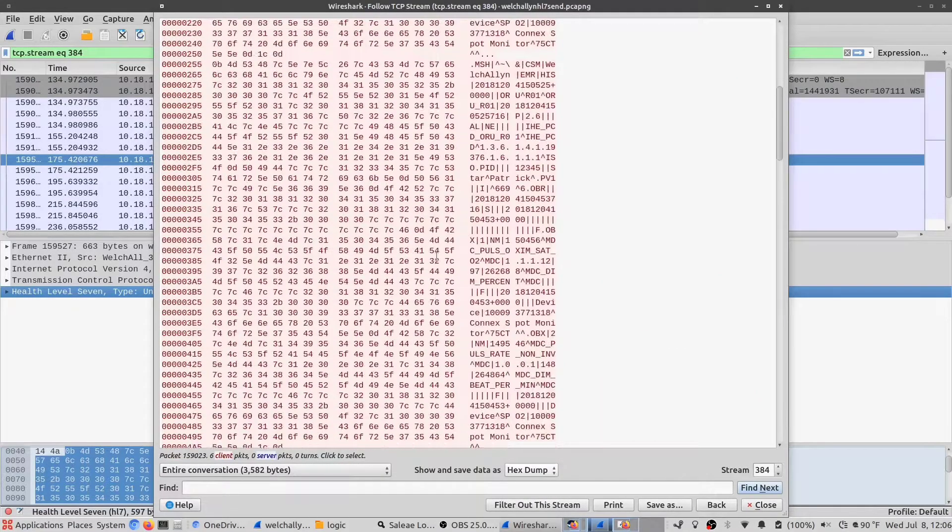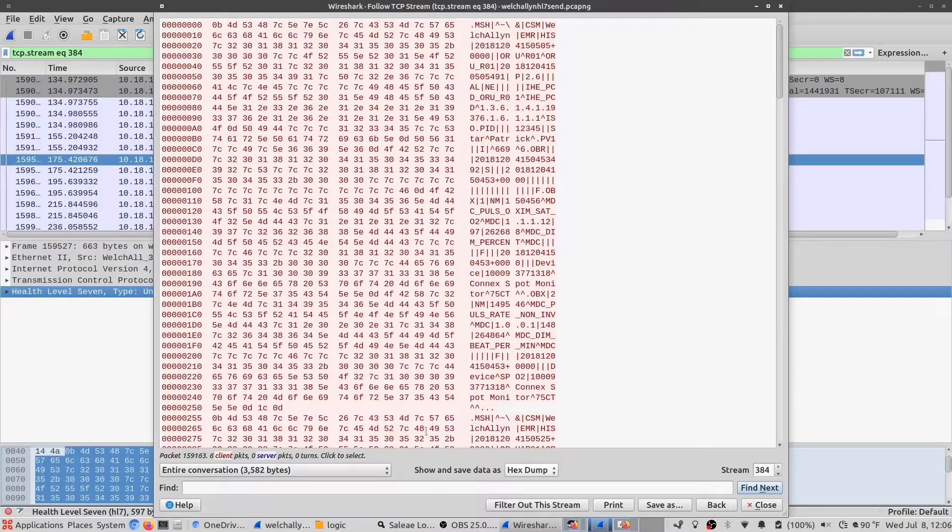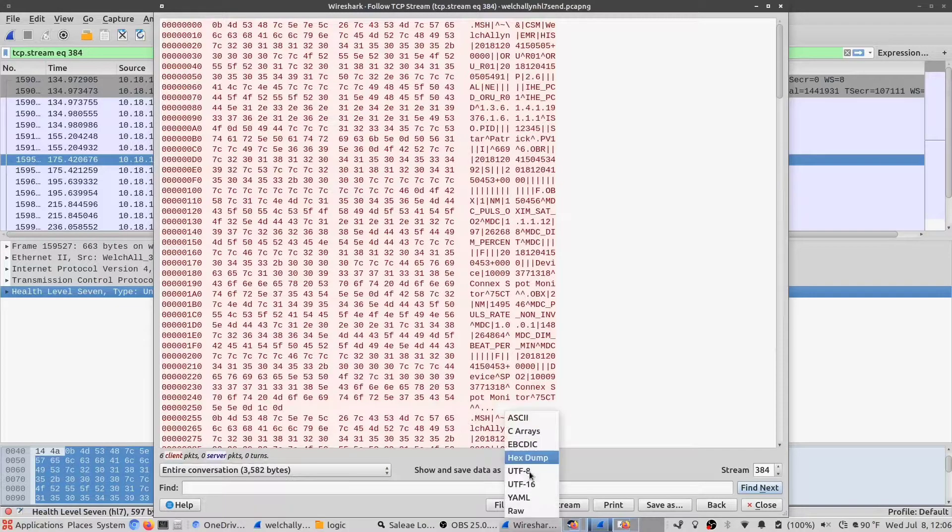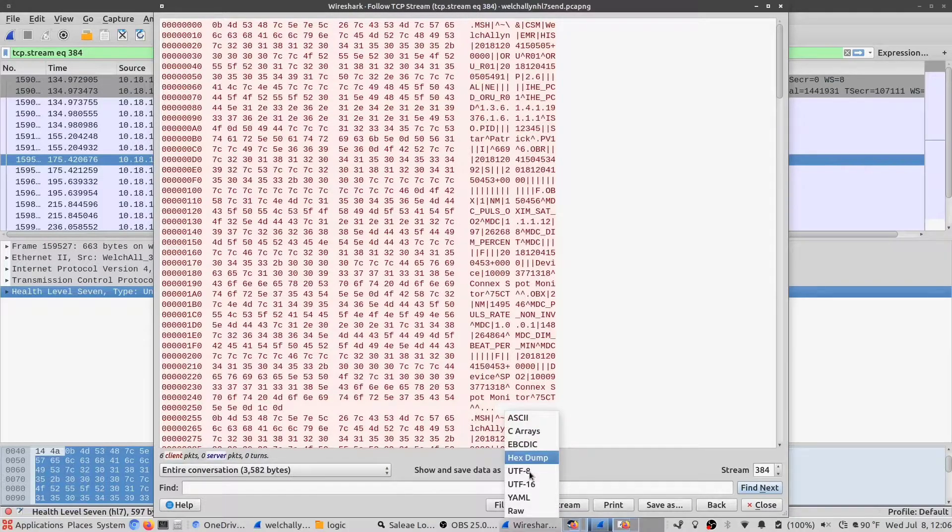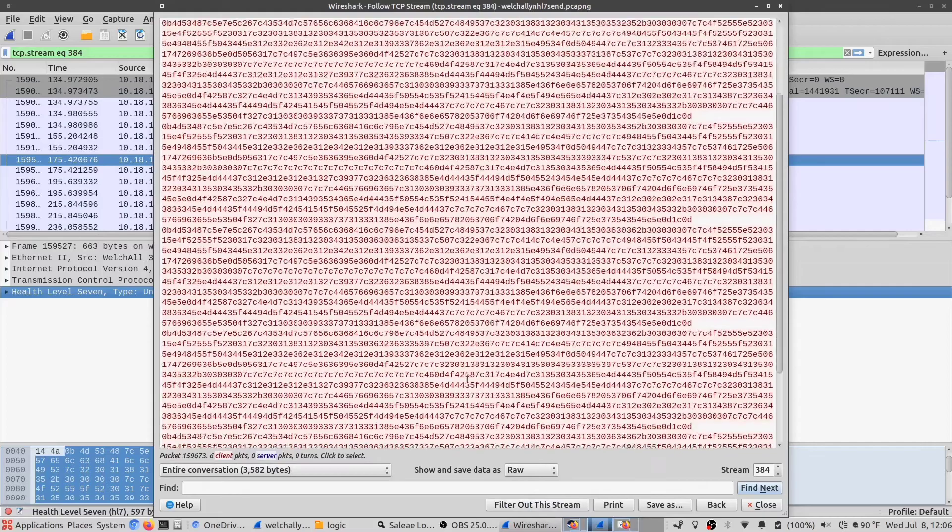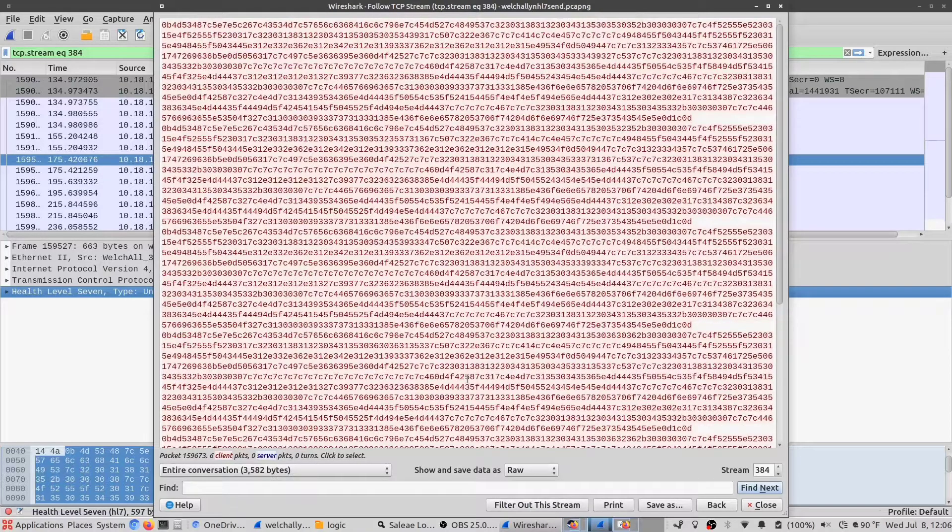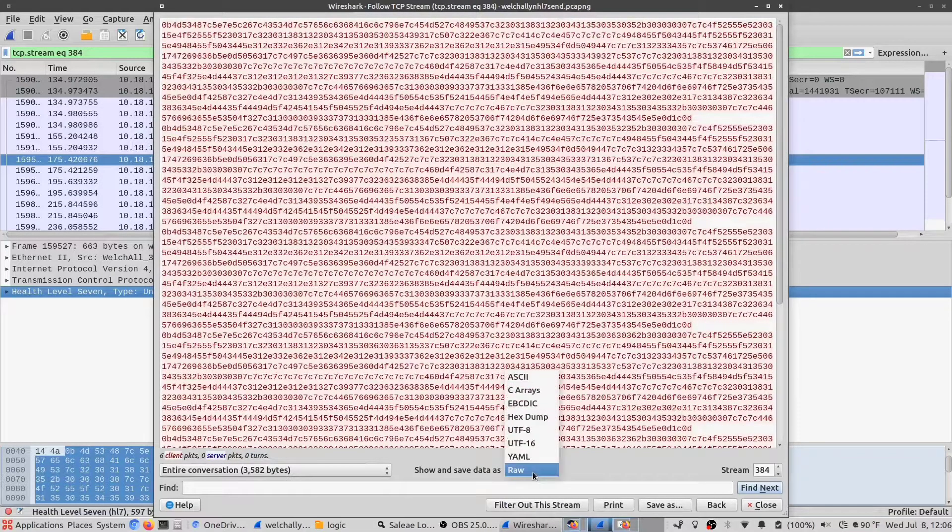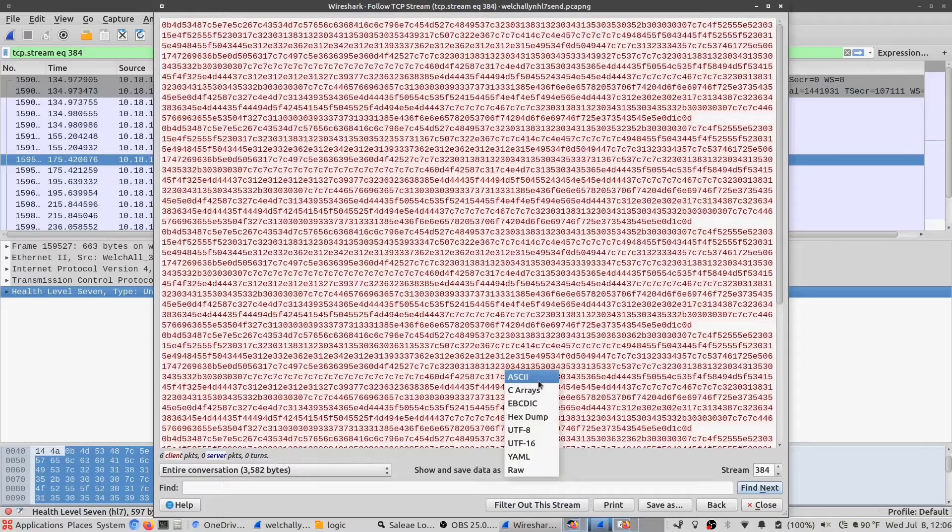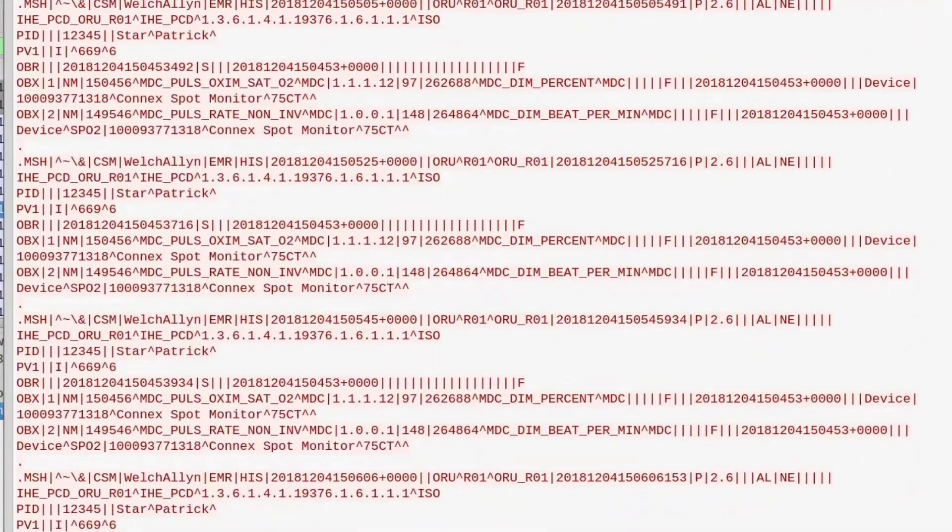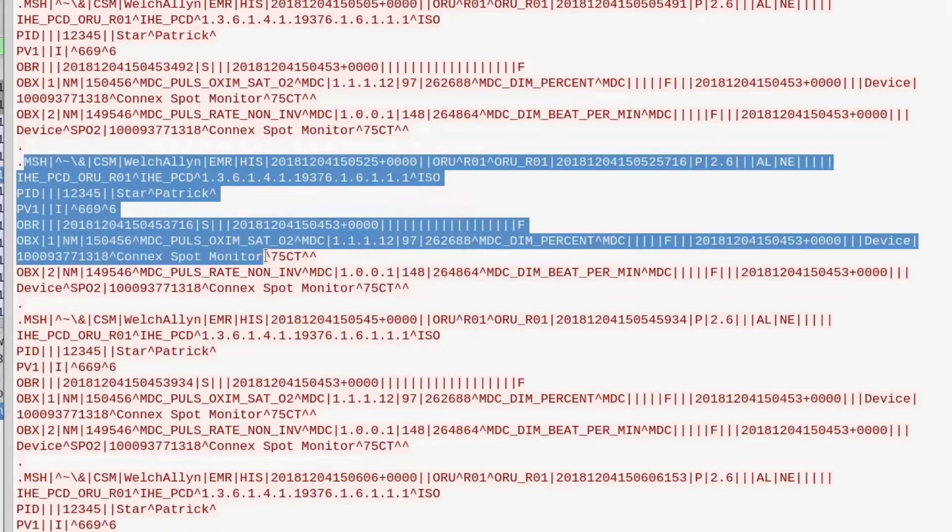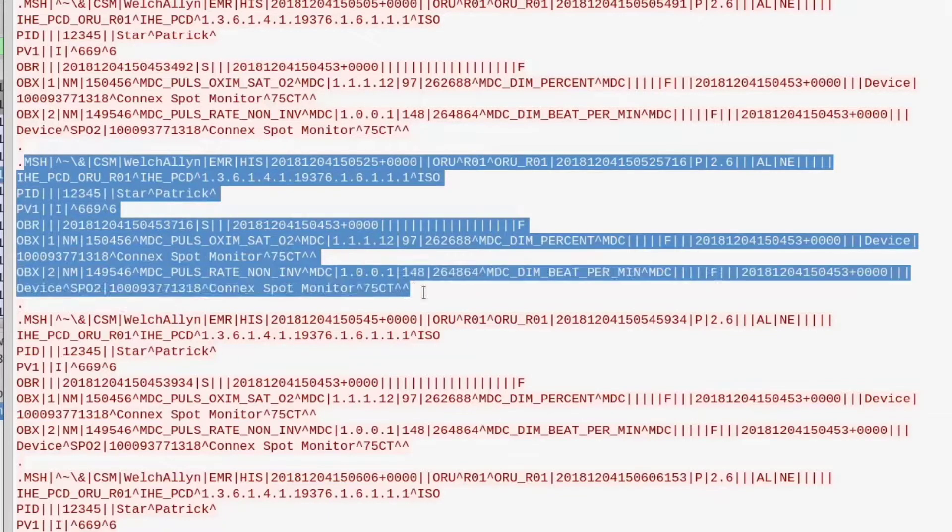and see the raw hexadecimal values, or even go into raw mode and see just pure hexadecimal packet information. But it's more useful in ASCII mode where we can actually see the HL7 messages themselves.